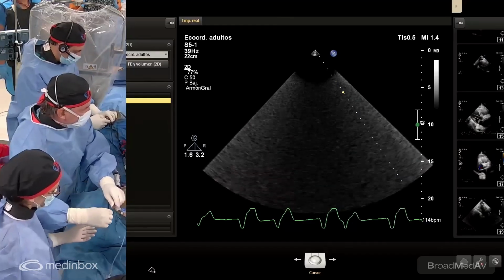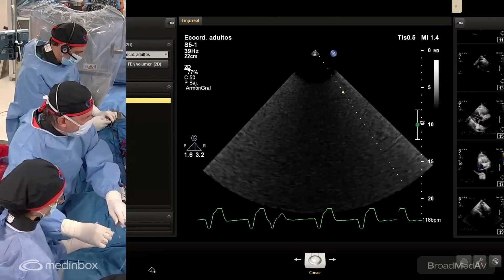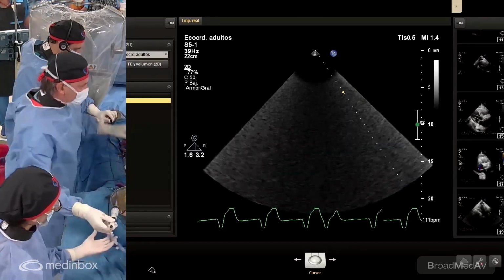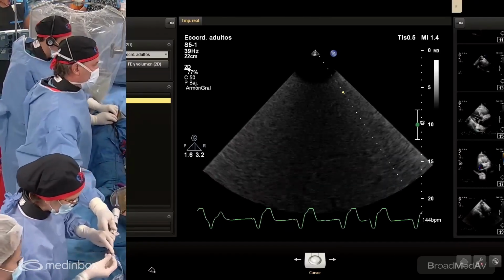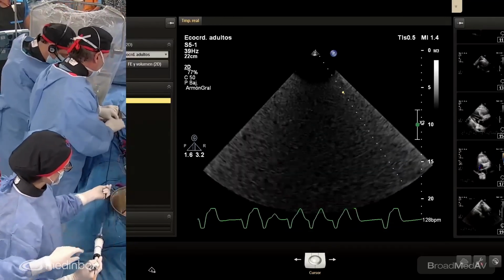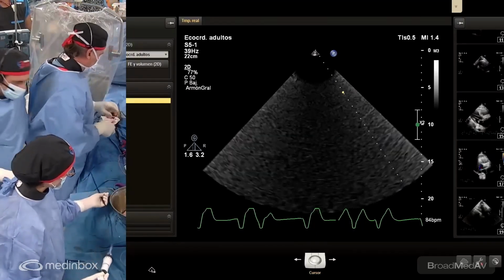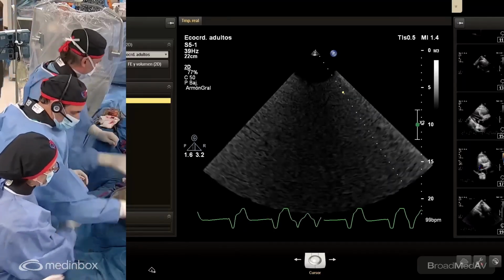You see that on the fluoro, what we try to do is not touch the sinotubular junction. The valve is exactly below. Push it here a little bit. The patient is so long that the wire is almost not enough. Release. Give me the picture.